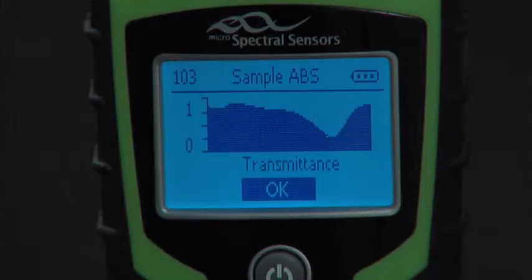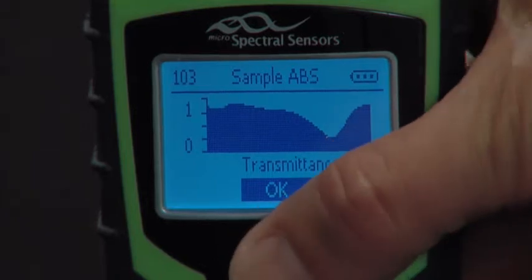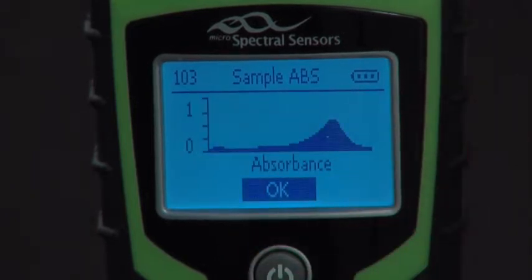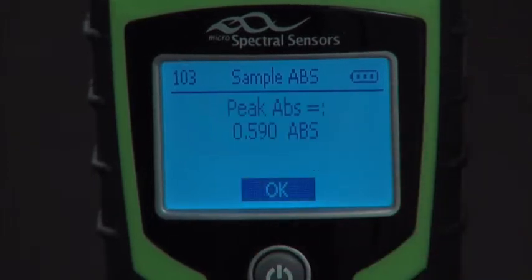The method will display a spectrum of the sample. We'll then press the center button. The method will then display an absorbance spectrum of the sample. Press the center button. We'll then report the maximum absorbance of the sample.